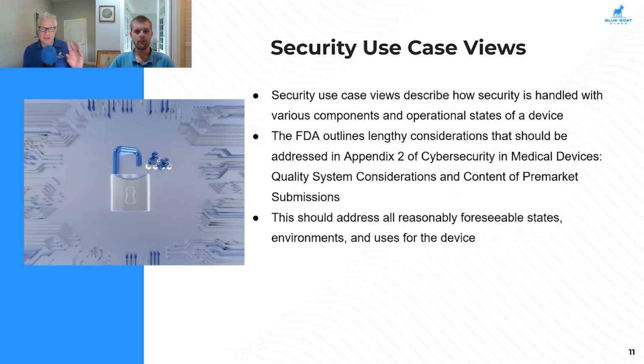Hey, let's take one step back here. I know we talked a little bit about operational states of a device with the last view and this one, specifically with the updatability view and the security use case views. What are the primary operational states of a device? The primary states that we usually factor in are power on, power off, standard operation, so like therapy administration, and standby, when the device is on, but it's not doing anything.